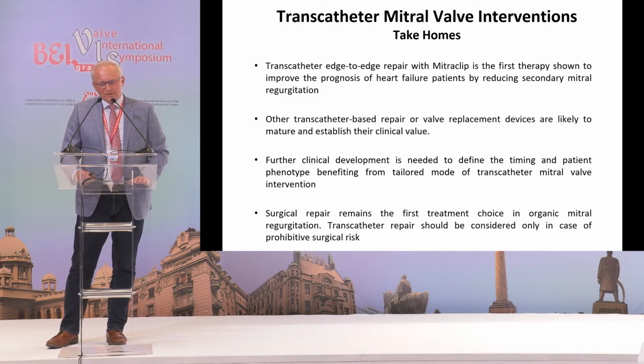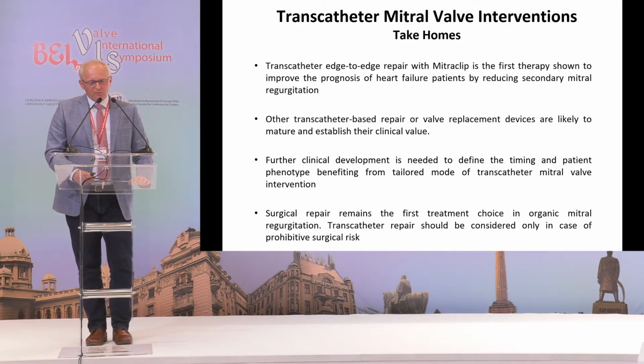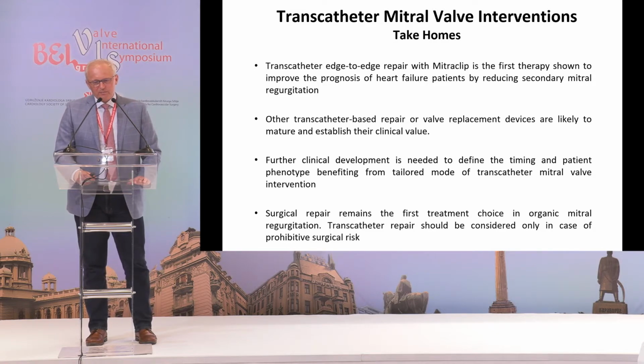Further clinical development is needed to define the timing and patient phenotype benefiting from tailored mode of transcatheter mitral intervention. Surgical repair remains the first treatment choice in organic mitral regurgitation. Transcatheter repair or replacement should be considered only in case of prohibitive surgical risk in this patient population.